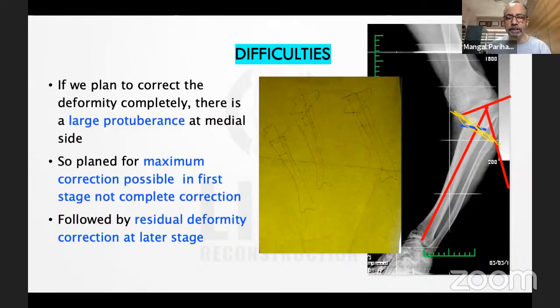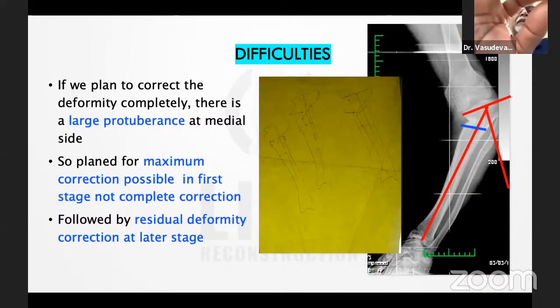Though conventionally we would say that you have to go parallel to the joint, with the kind of experience we have, we go into a slightly different mode because we anticipate that this is going to create that problem once we get it corrected. And that spiky bone is actually of no use and it produces pain. Correct. But you are actually saving more bone this side. Okay. The next thing is you can go higher up.